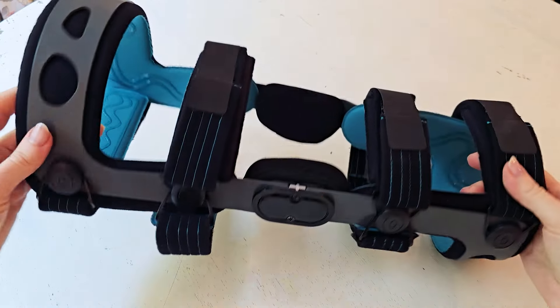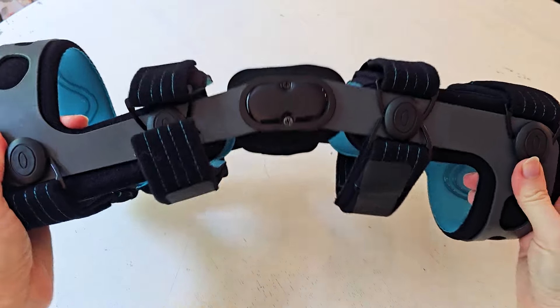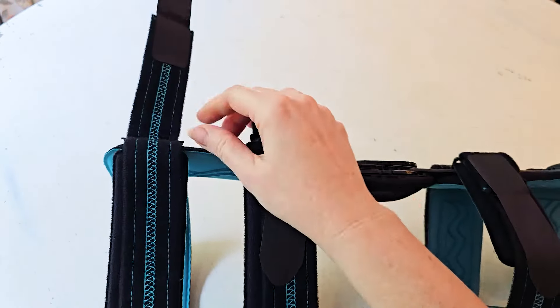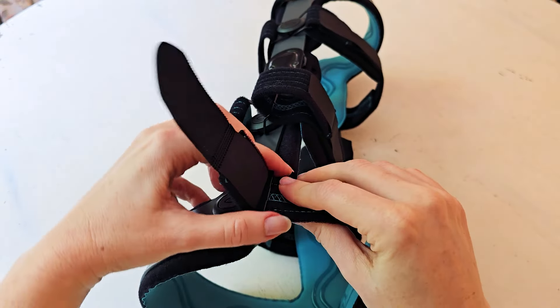The brace itself comes very well packaged. It comes in both a left or right, as well as multiple sizes, and these sizes are universal, meaning they are good for both men and women.